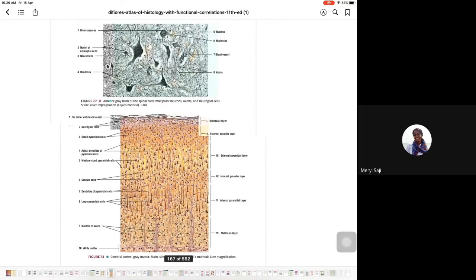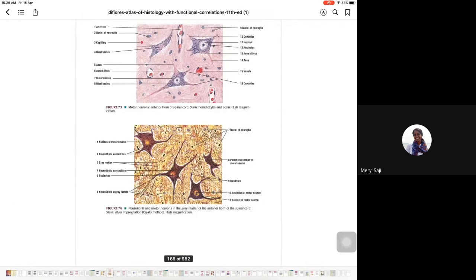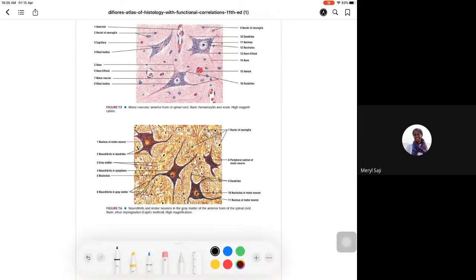And see, I forgot to mention the neuropil in the background. Even we can go to the previous thing and see. This is the neuropil. I told you, it is fibrillary pink material. Can you all see it? These are all the neuropil.